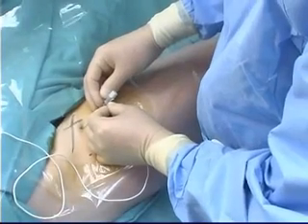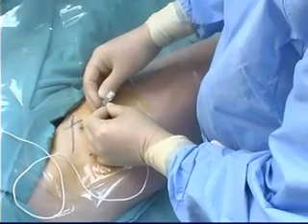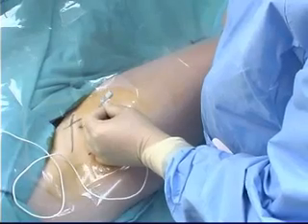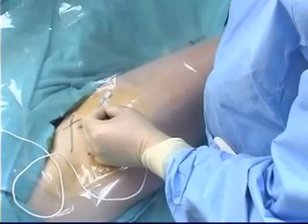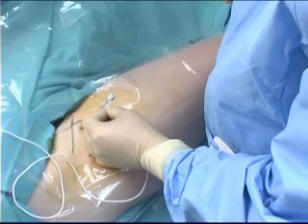The nerve stimulator output is turned down to between 0.3 and 0.5 milliamps, and a brisk motor response of the quadriceps muscle should still be present. This ensures correct needle placement deep to the iliaca fascia, but it does not assure accurate catheter placement. It is essential not to inject any local anesthetic agent or other electrically conductive fluid, such as normal saline, through the needle at this point, since this will render stimulating catheter placement impossible.